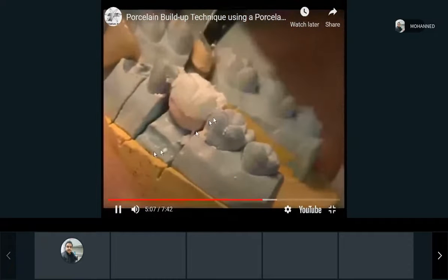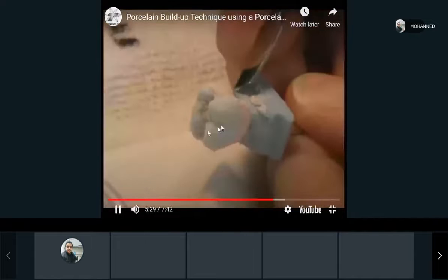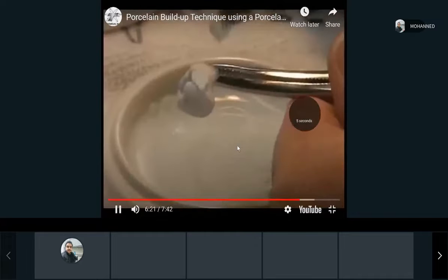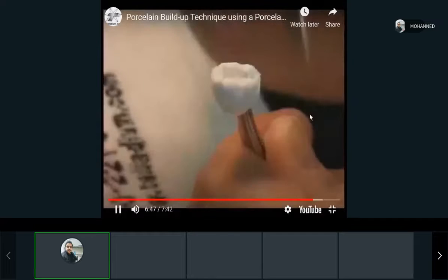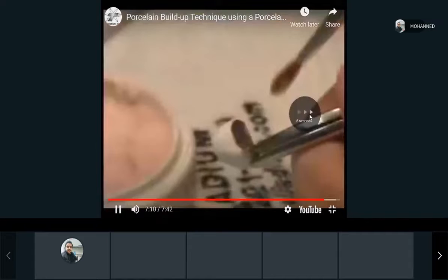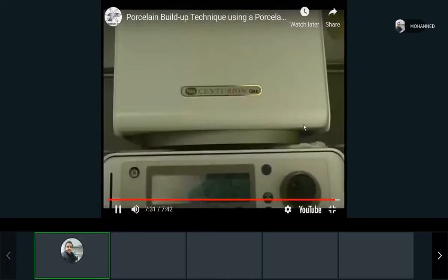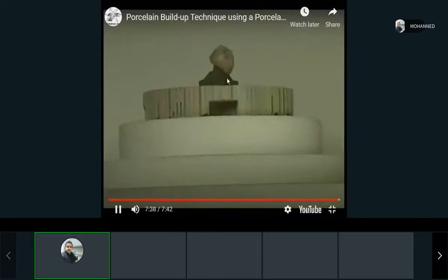Let's see, they're going to remove the die out of the cast. You see how they have it cut? There it goes. They removed it. Now they're going to remove the crown so they can work on it separately. You see it has the metal part on the bottom, and then they just keep building it up again and again and more and more until they make it. This is the metal part, which is the coping that was done by the lost wax technique. They finish it, they make it look pretty, and they fire it in an oven. When we say fire it, that means to heat it up to a really high temperature. And there it is. That's a porcelain fused to metal crown.